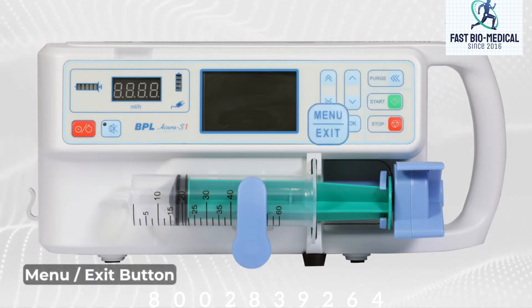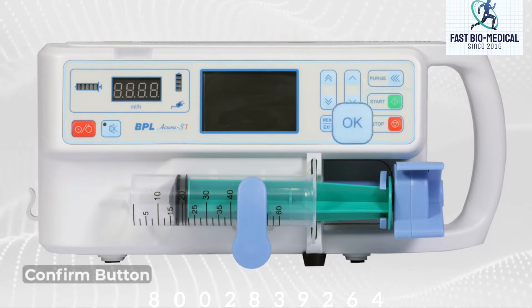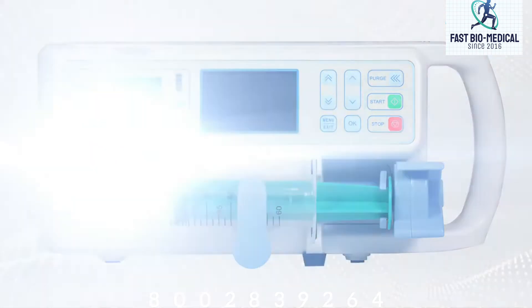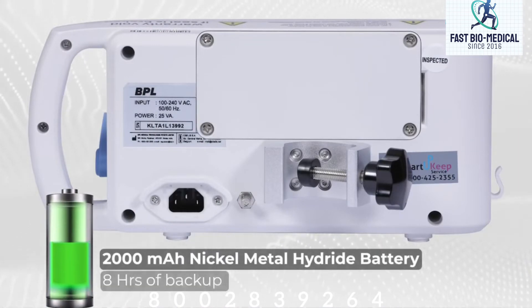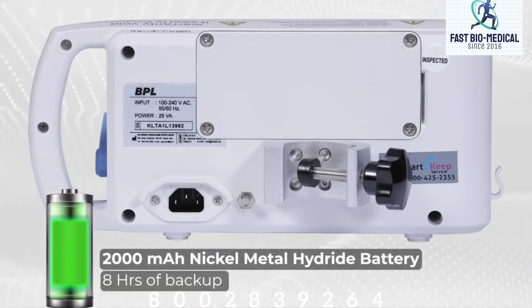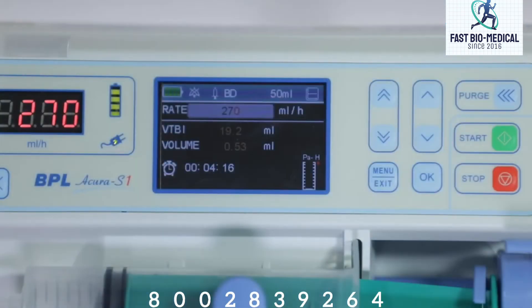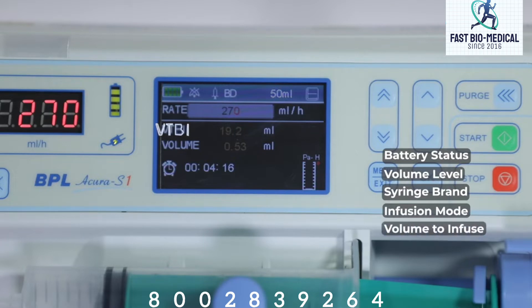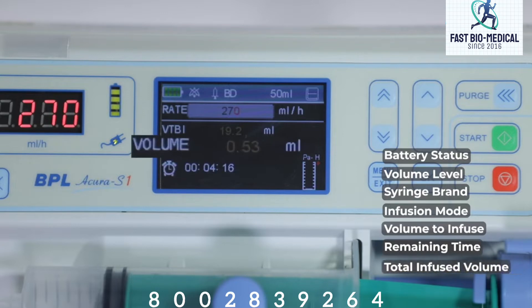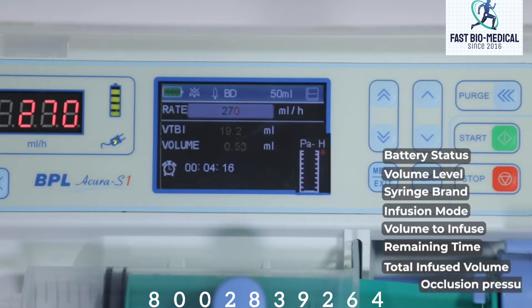This is the menu or exit button and this is the confirm button. The device has a 2000 mAh nickel metal hydride battery which gives 8 hours of backup. As you can see, the screen shows the battery status, volume level, syringe brand, infusion mode, volume to be infused, remaining infusion time, total infused volume, and occlusion pressure set.